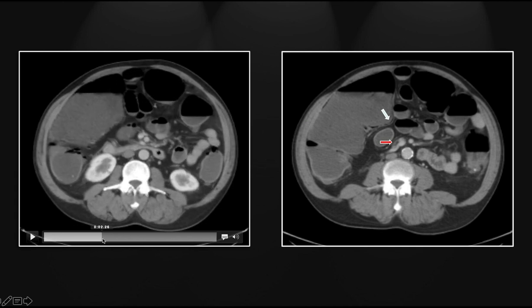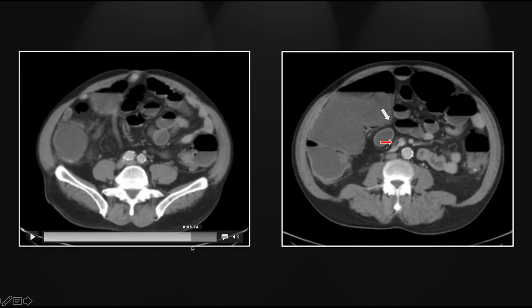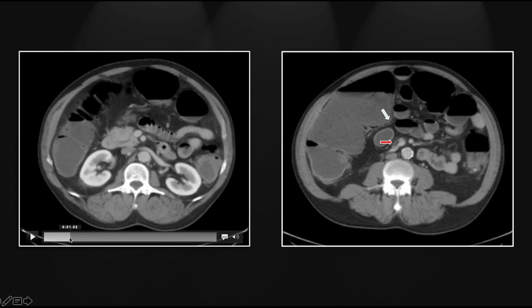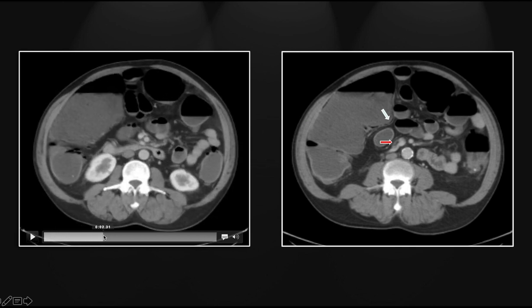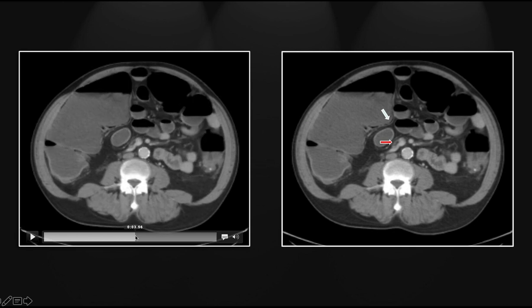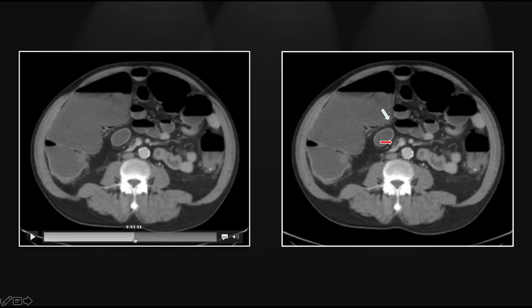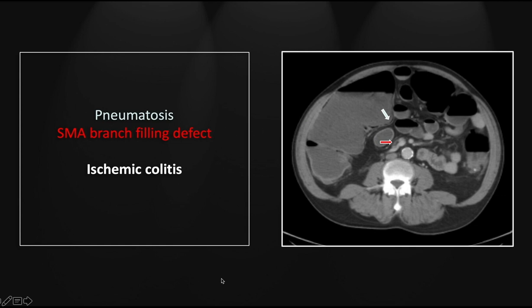Let's look first at the pneumatosis involving the cecum and ascending colon. You can see really throughout all of the proximal colon that pneumatosis is present. Now let's go to that superior mesenteric artery filling defect. You can see the artery right here at its origin, and if we follow it superiorly, there is a tiny filling defect right there. So this is a thromboembolic proximal colonic ischemia.